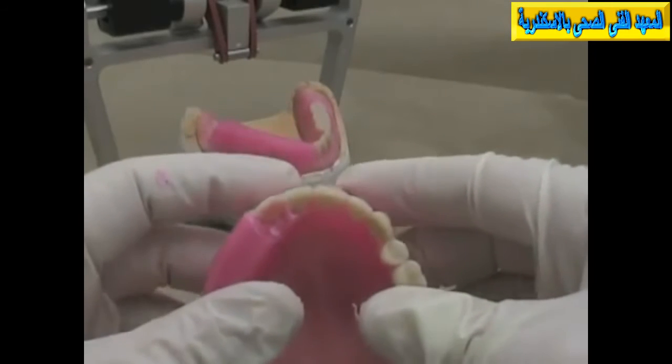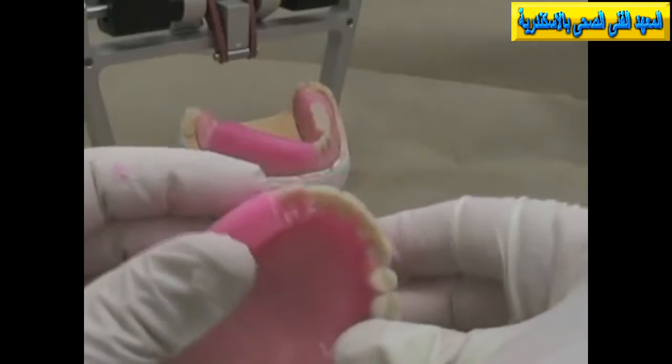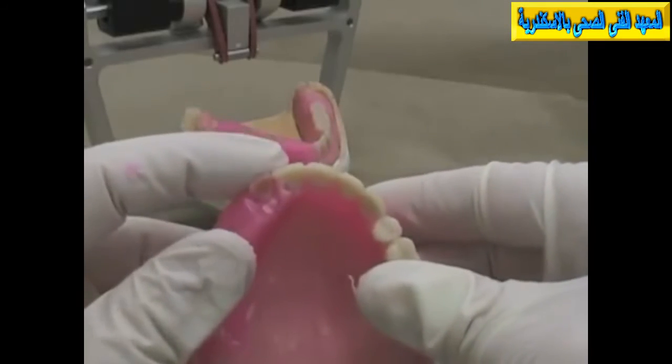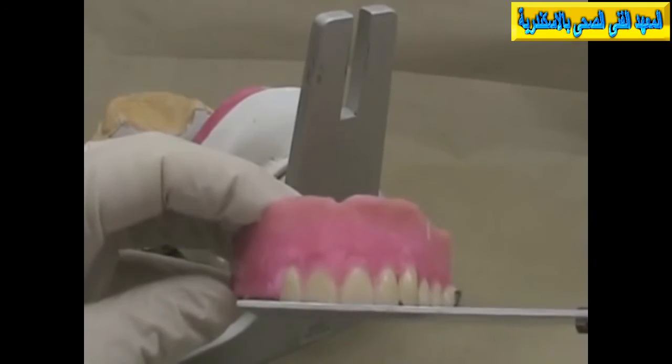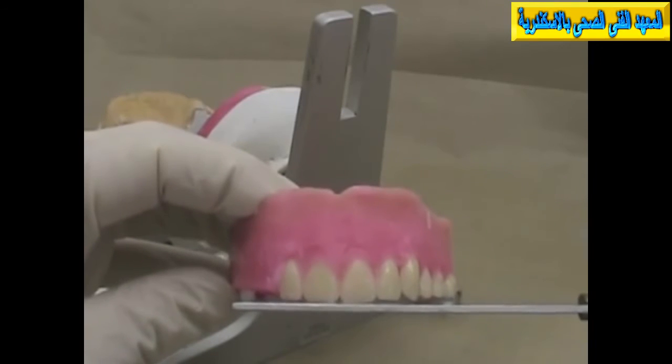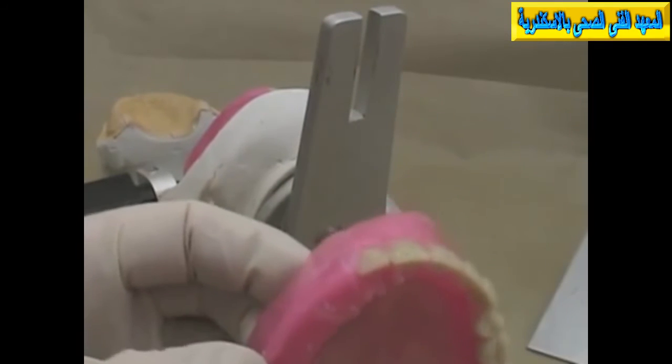Make sure that the neck is not more prominent. You can do that by sort of angling the denture around and looking from all different perspectives. Then also don't forget to put it back on your articulator and check your overjet with the adjacent tooth and also on the opposite side to see that you're getting about the same amount of overjet from side to side. Again, you can use some sort of straight edge to check that your lateral incisor is slightly above the edge of the central incisor. So lateral incisor slightly above. Make sure that that neck is not too prominent.